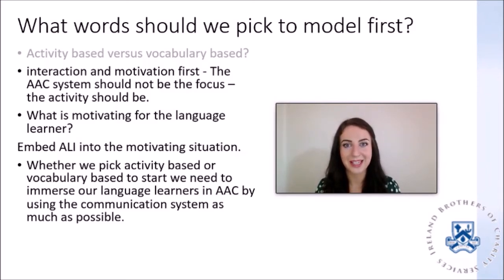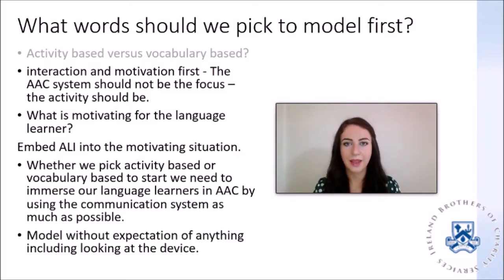So remember the 5-second rule. We don't want the language learner to start associating the device only with mealtimes and then get confused when we suddenly have the device in the car. So you can start by modeling at mealtimes, but keep the device out and with the language learner for the whole day.